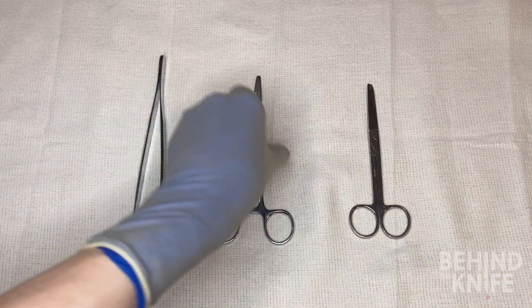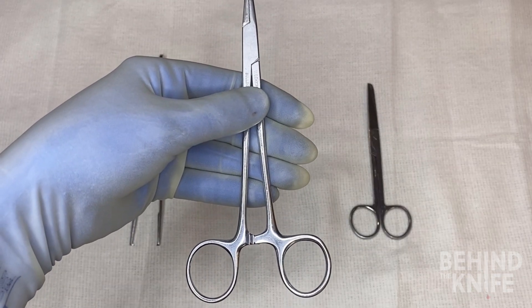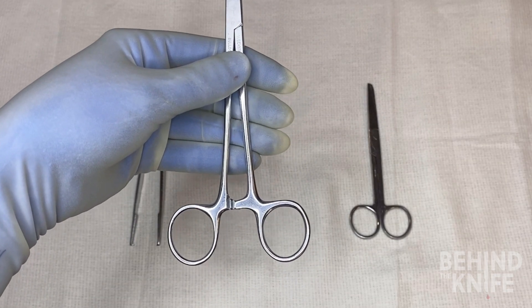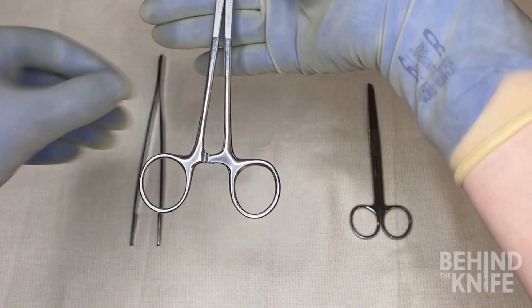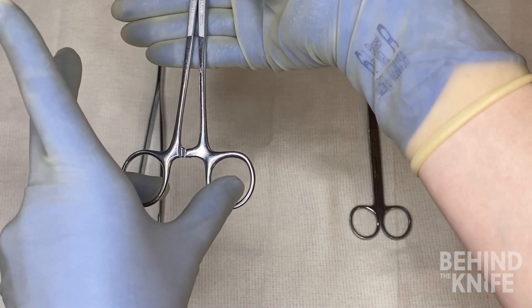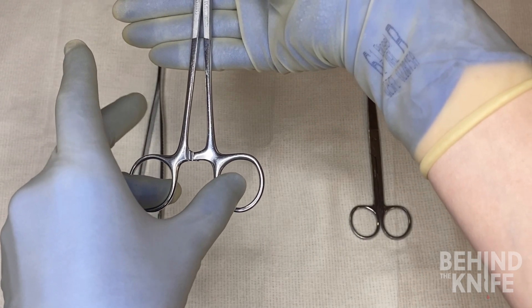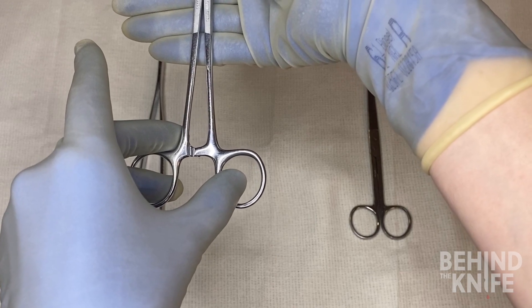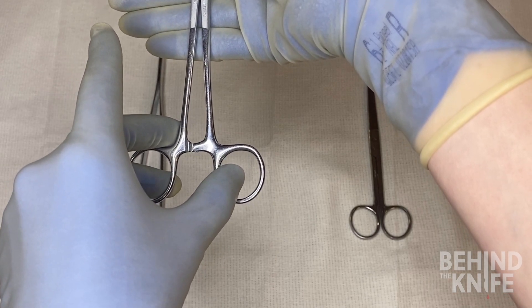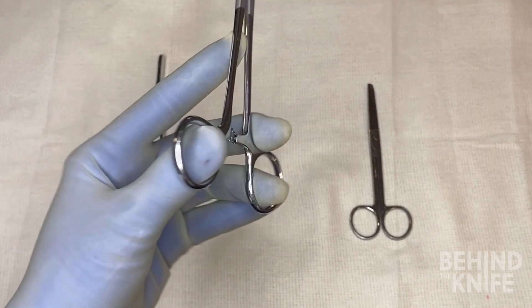Next, we'll move on to your needle driver. You may see your attending or residents hold this instrument in a variety of ways, but generally the best way to hold this instrument when you're first starting is to place your ring finger and thumb into the finger holds. Place your middle finger on the outside of the finger hold where your ring finger is, and place your index finger along the length of the instrument for stability.